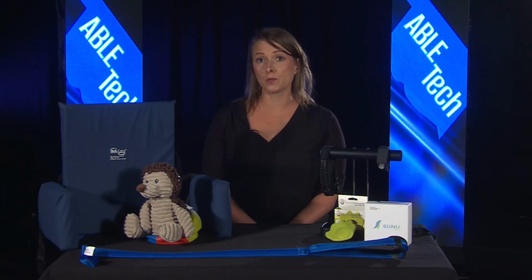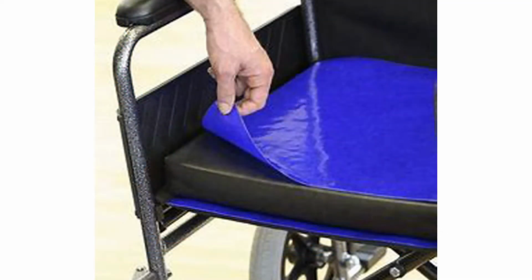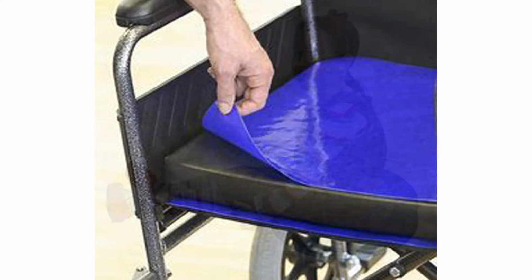Grab a beach ball and inflate it with only 1 or 2 breaths. Then place the beach ball on a chair and have a child take a seat. The Dycem non-slip rectangular pad provides a secure, stabilized surface that anchors items to a hard surface. When used in a seat, it helps a person stay in place.